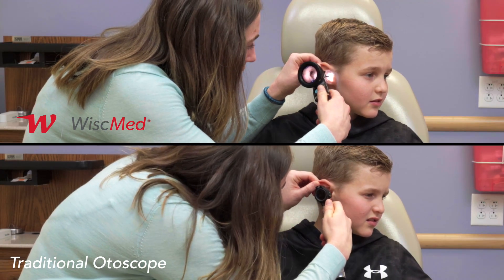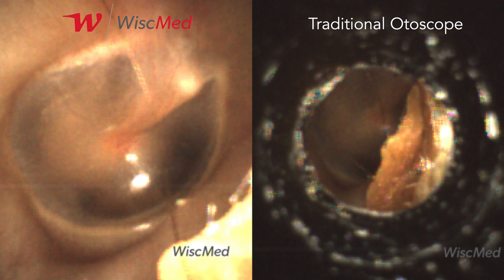I can actually set up the Whisper and be a little bit more distant. Even in the smallest ears, the Whisper will open your eyes to details that were previously only obtained with expensive and bulky devices.